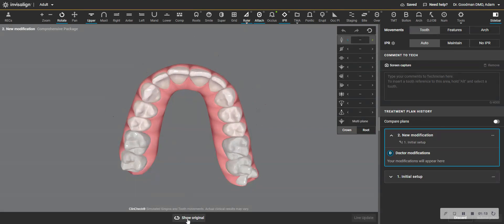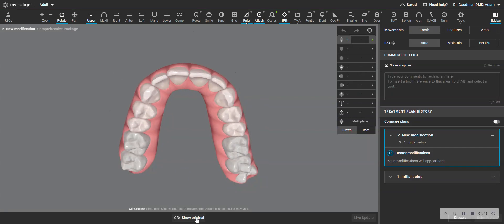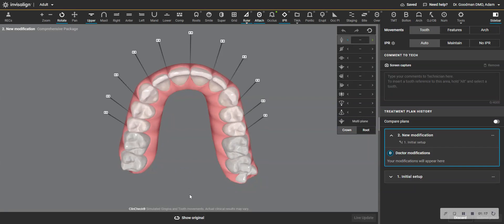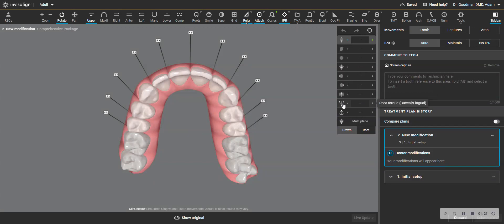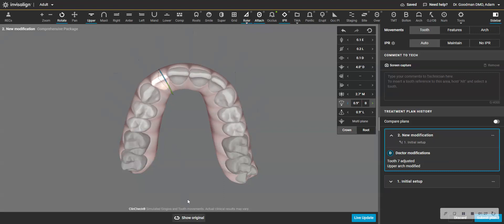But especially on number seven, I don't need to move that tooth bodily like that because that is hard to track. And it's such a small movement. So what I do is I take the root torque and I put it back kind of where it actually is.